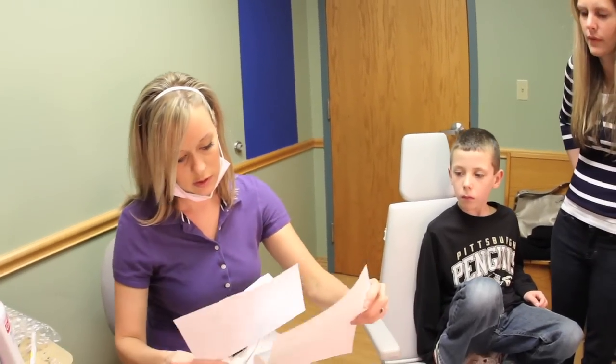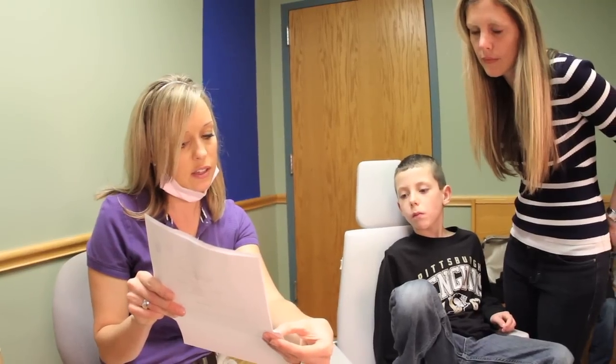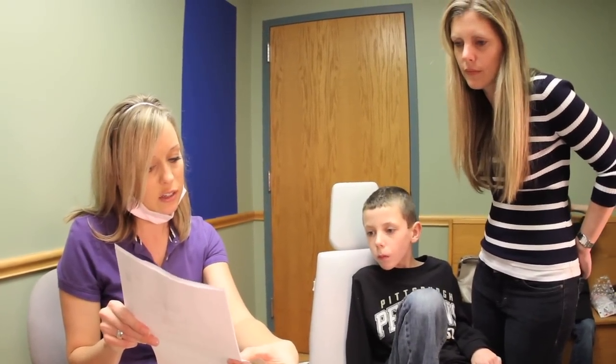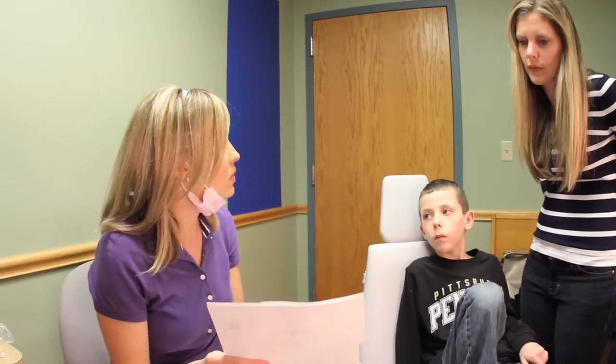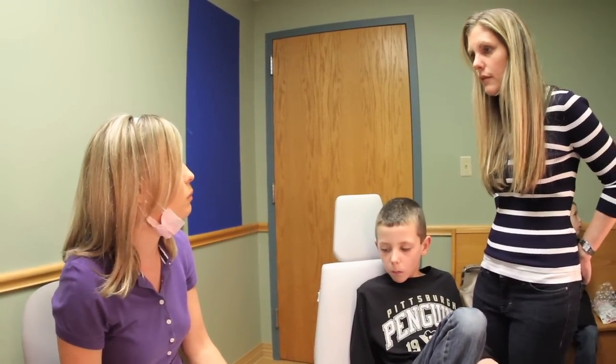The patient manager will go through all the instructions with the patient and parent, including foods to avoid and how to keep the expander clean. We also cover hygiene, diet, and speech. Their speech may sound a little bit unlike themselves at first, but the more they talk and get back to their regular activities, the more they'll start sounding like themselves.